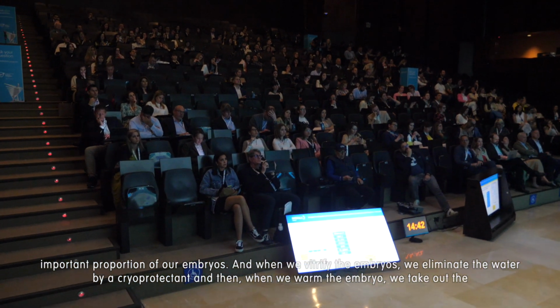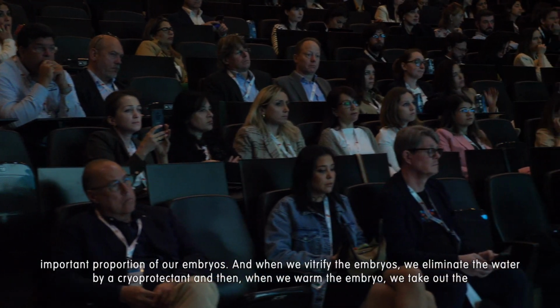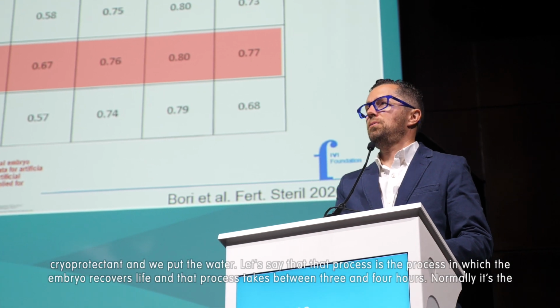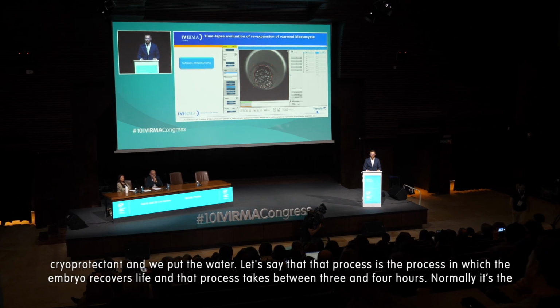When we vitrify the embryos, we eliminate the water, or we substitute the water by a cryoprotectant, and then when we warm the embryo, we take out the cryoprotectant and we put the water. Let's say that is the process in which the embryo recovers life. And that process takes between 3-4 hours normally, which is the time that we leave the embryos in the incubator from when we warm until we transfer to the mother.